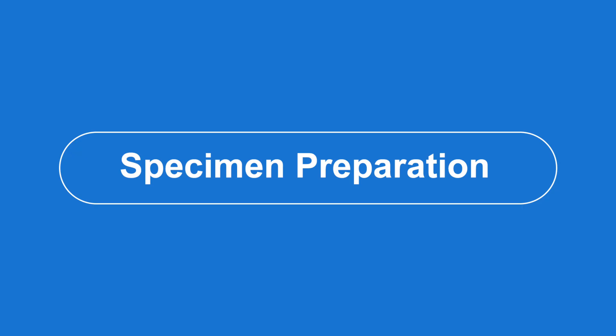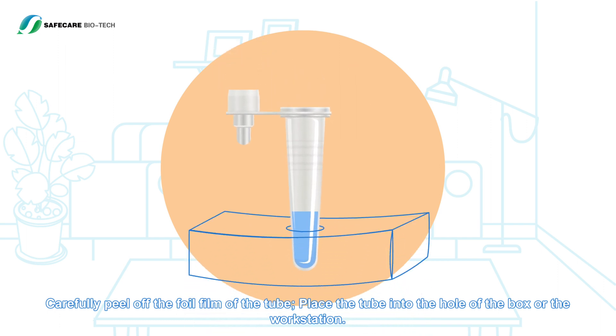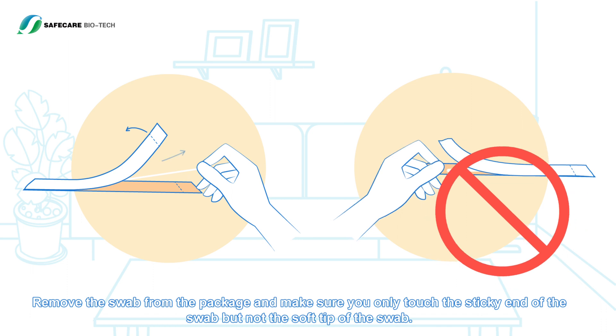Specimen preparation: carefully peel off the foil film of the tube and place the tube into the hole of the box or workstation. Remove the swab from the package and make sure you only touch the sticky end of the swab, not the soft tip.